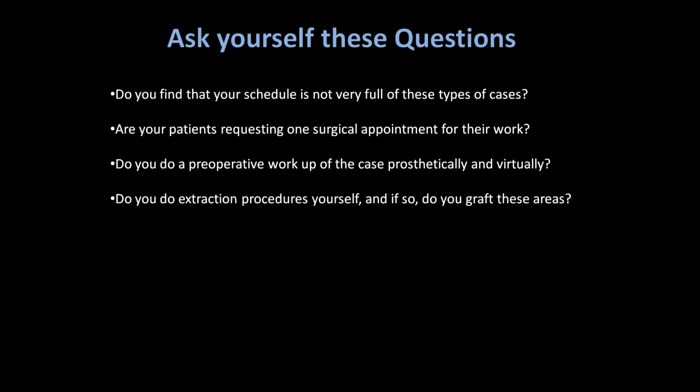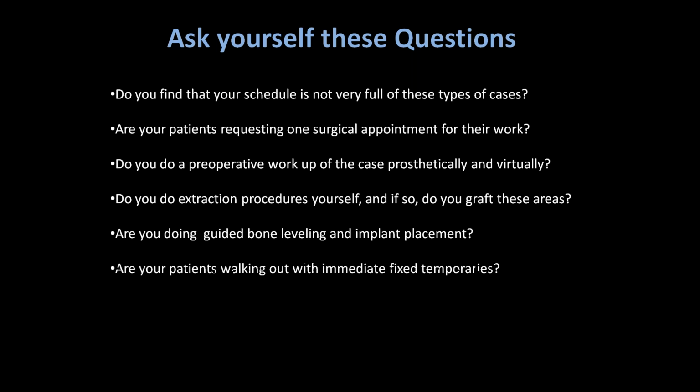It's important to note, as you saw with the examples earlier in the presentation, that patients are not just presenting with full edentulous ridges. If you want to provide implant therapy, you also have to know how to extract and graft to set the foundation for these patients. If you are providing implants, are you doing it with guided surgery? Whether it's the leveling of the bone or the placement of the implants, this evening we'll talk about using guided surgery to be able to offer this type of service.